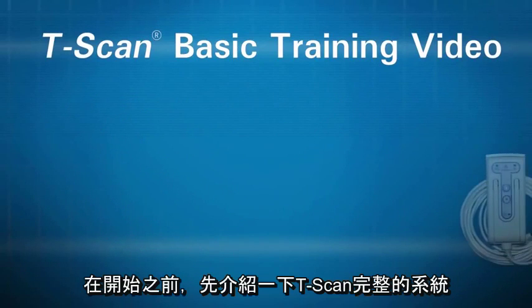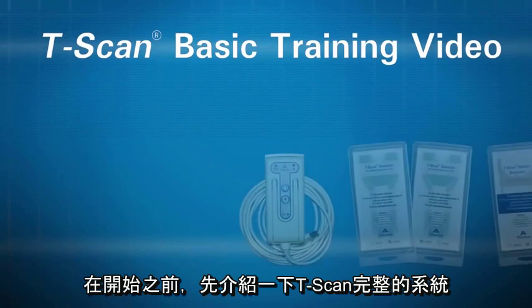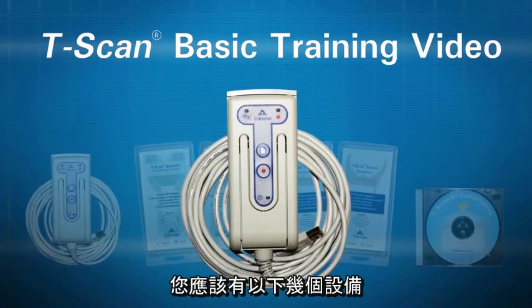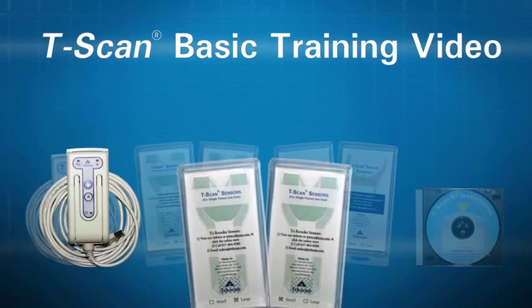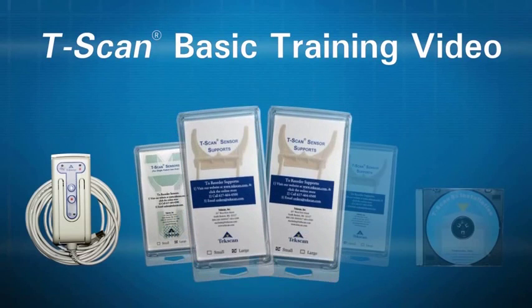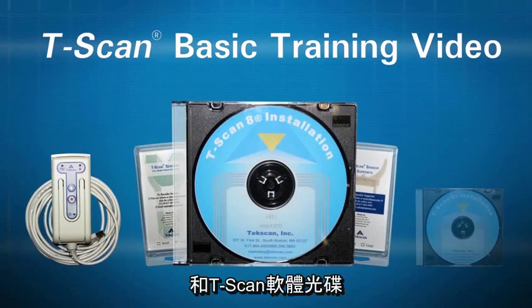Before we begin, let us take a moment to verify that your T-Scan system is complete. You should have the following parts: one scanning handle, one box of large and one box of small sensors, one box of large and small supports, and the T-Scan software disk.